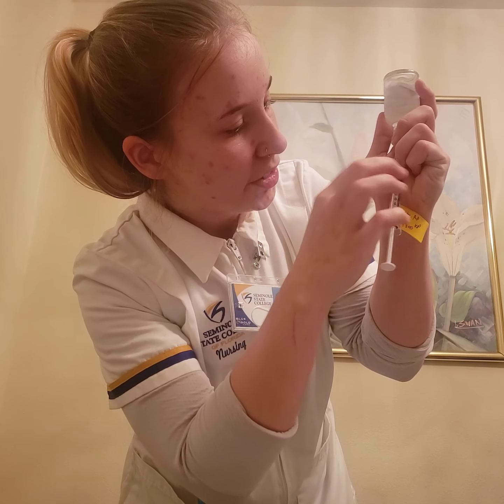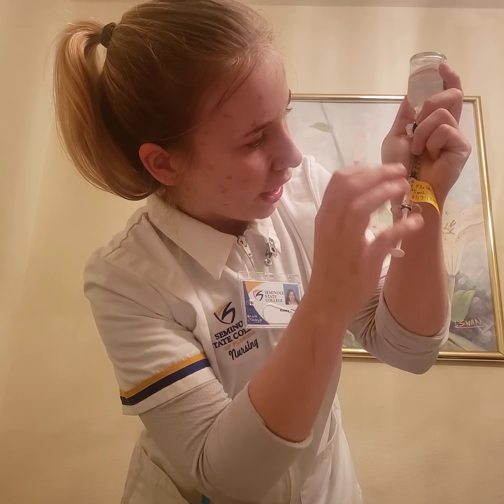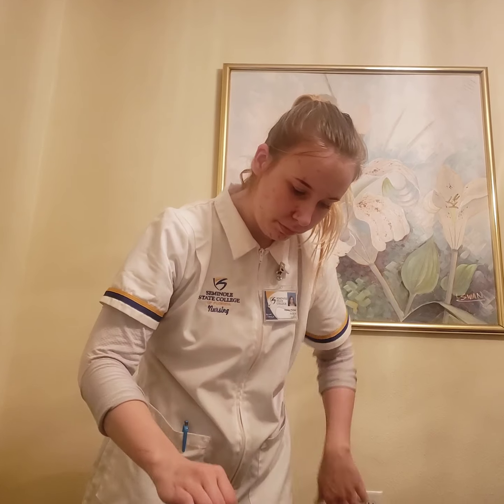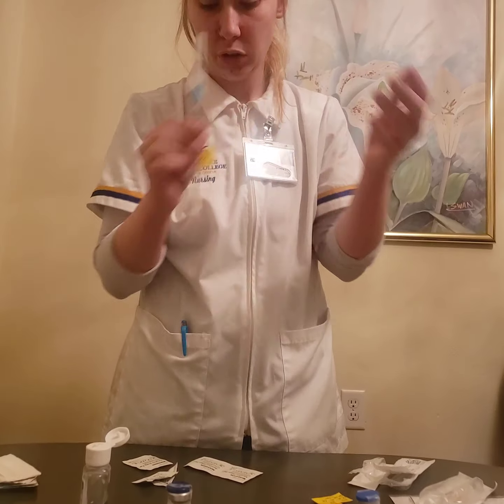I know I need to tap my syringe to get all my little air bubbles out and to be able to give an accurate amount of medication. Okay, good here. I'm going to recap my needle safely.